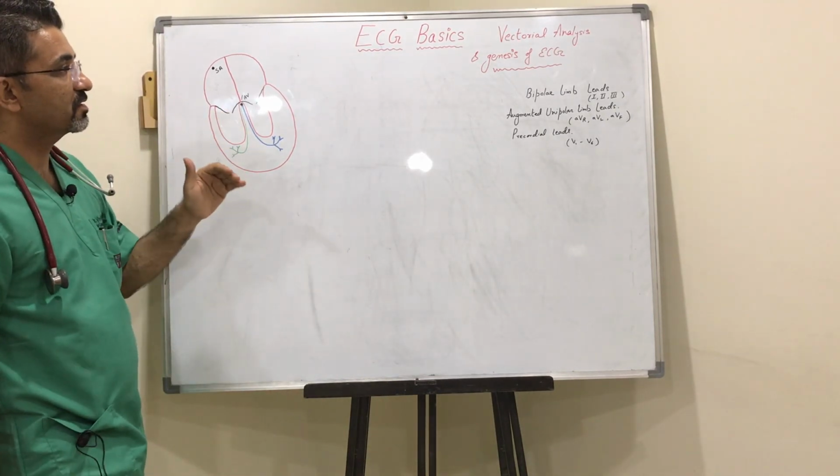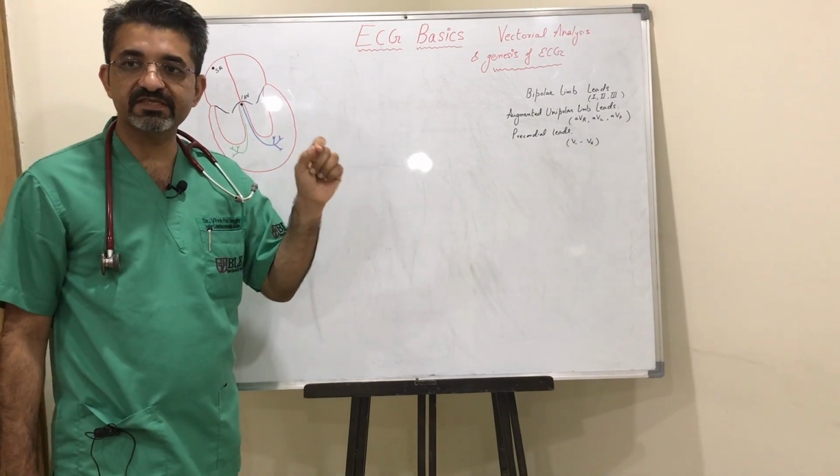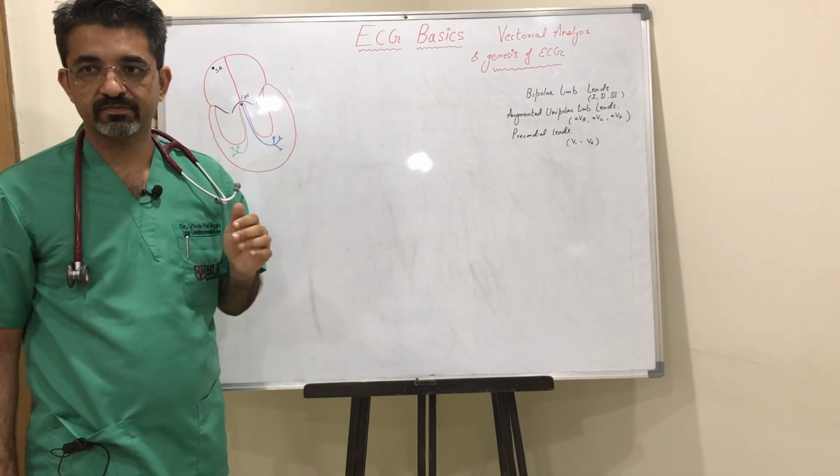Now when we try to understand the very basic of ECG, we always take lead 2. There is a reason.